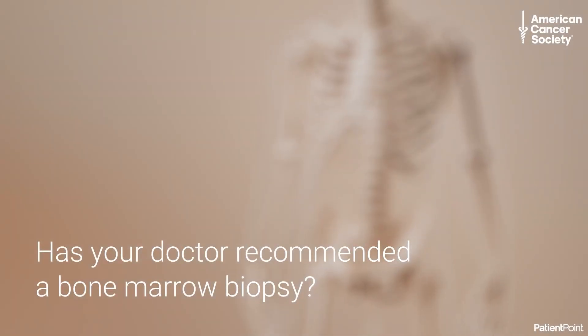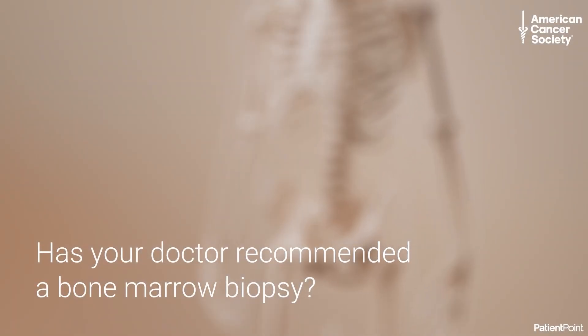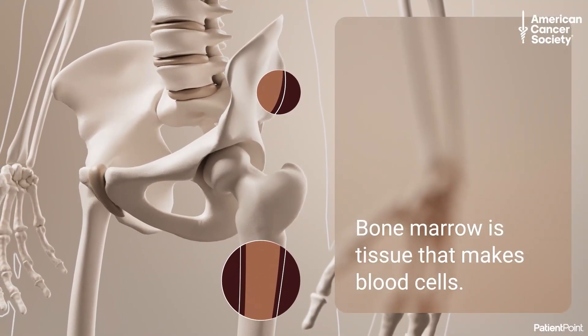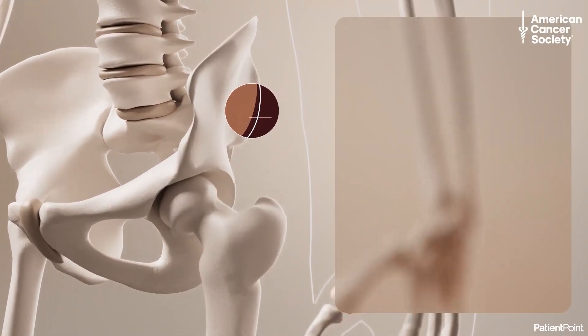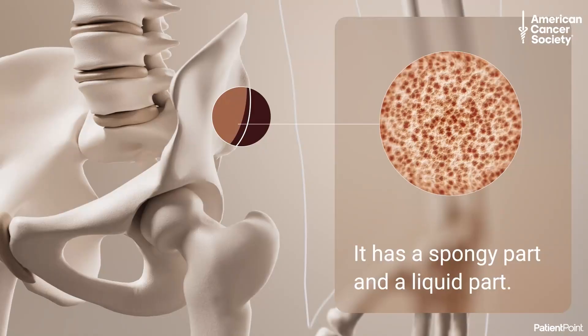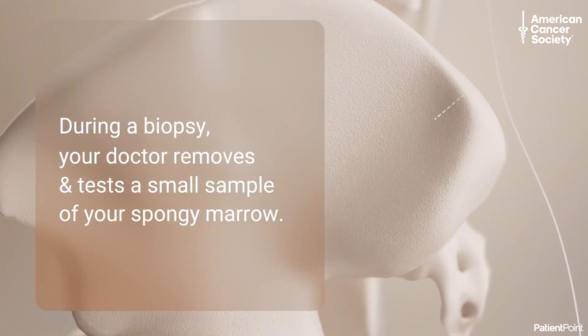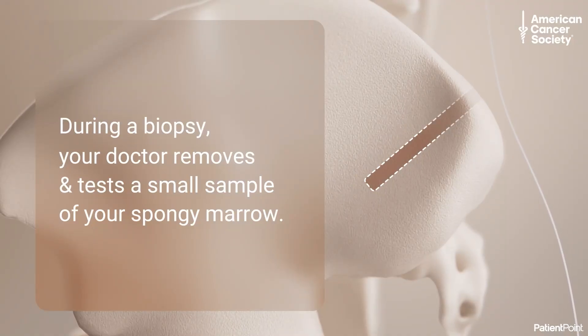Has your doctor recommended a bone marrow biopsy? Bone marrow is tissue inside your larger bones that makes blood cells. It has a soft spongy part and a liquid part. During a bone marrow biopsy, your doctor removes and tests a small sample of your spongy marrow to see if it's healthy and making blood cells like it should.